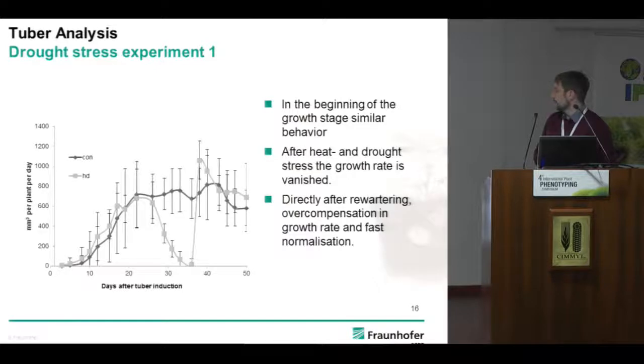What you can of course do as well is directly calculate the growth rate, because it's a non-destructive method and we know the stage at our first measurement time point and the next, so we can just calculate the rate of growth. You can see directly, starting at day 20, under stress the growth rate stagnated and decreased down to 0 within the 2 weeks.